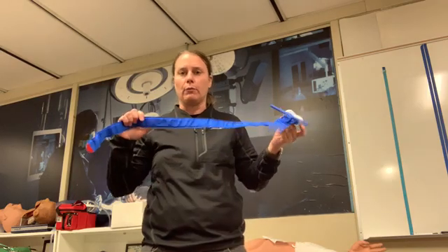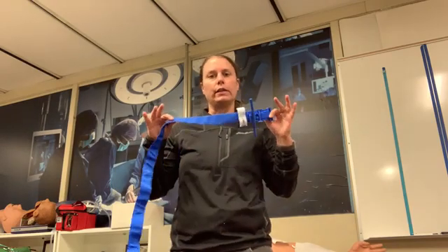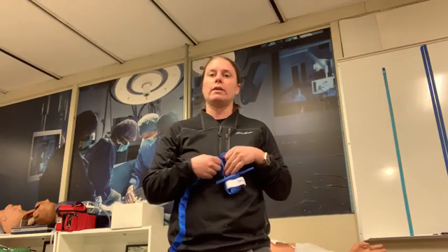And if I'm limited on my resources and only have so many of these, I want to make sure that it's going to work. Because the rules with these are once they're on, they don't come off except from a surgeon. So I don't get to take it off if I think it's working. I don't get to take it off if I think I put it on too loose. I don't get to take it off if I want to move it higher. Once it's on, it's on.